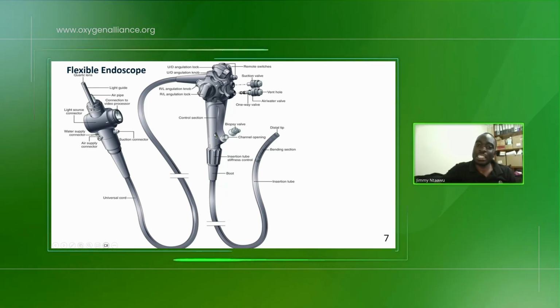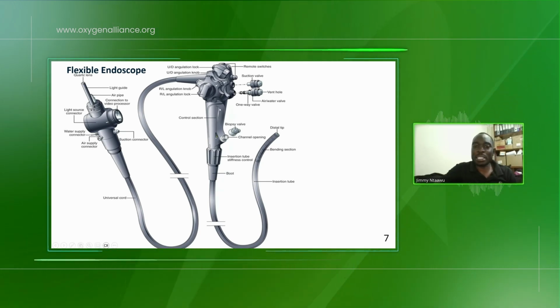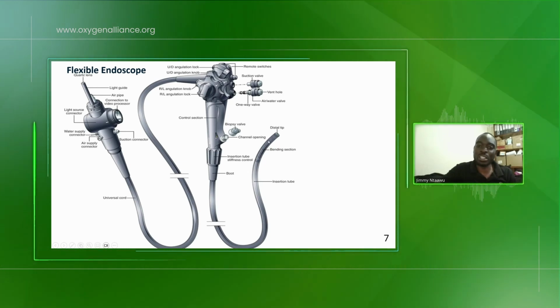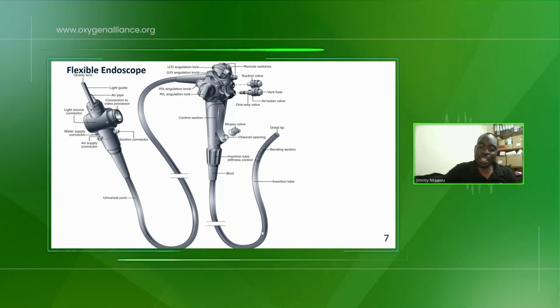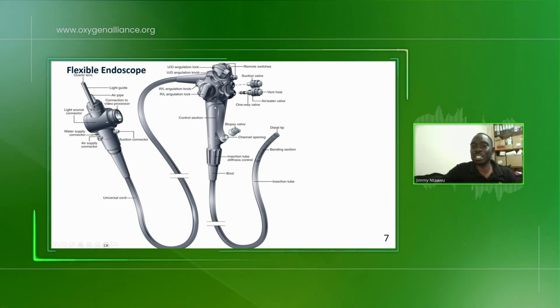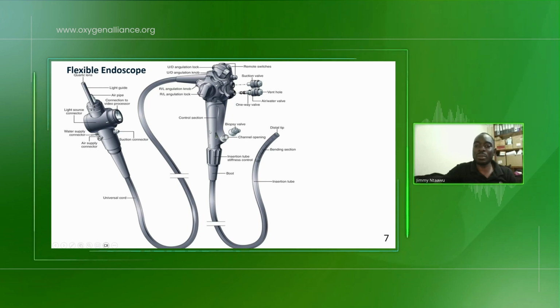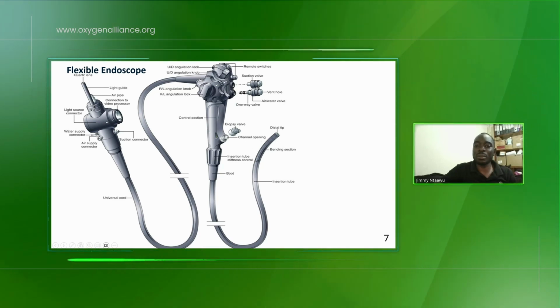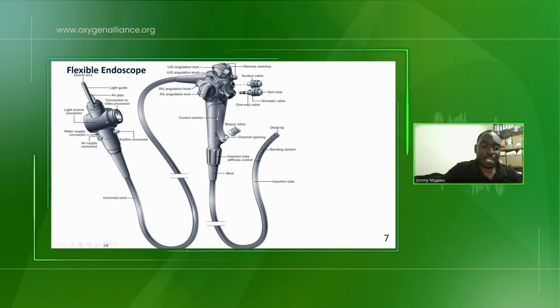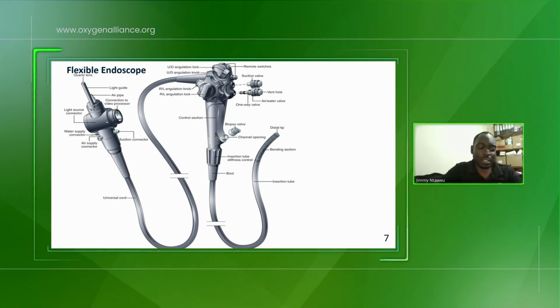It's not a major repair, but you need the tools and the spares to replace the whole wires, because the wires run all the way from here through the scope and they are controlled around this area. So the snapping happens in this area here, whereby the knobs disconnect from the wires that control the bending section. It's very common with the doctors, but they rarely admit it. But just know as biomeds, that's a problem caused by doctors.